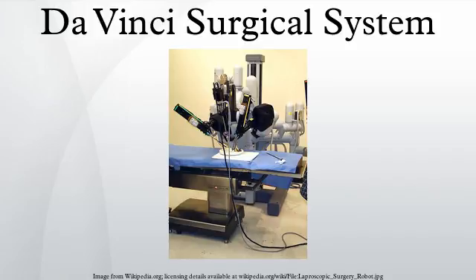The current system is designed merely to replicate seamlessly the movement of the surgeon's hands with the tips of micro-instruments, not to make decisions or move without the surgeon's direct input. The possibility of long-distance operations depends on the patient having access to a Da Vinci system, but technically the system could allow a doctor to perform telesurgery on a patient in another country.